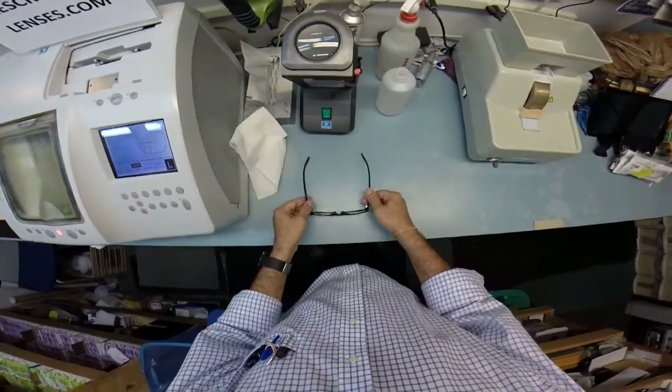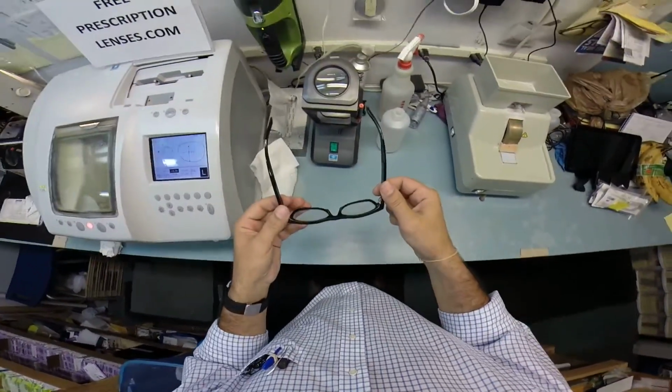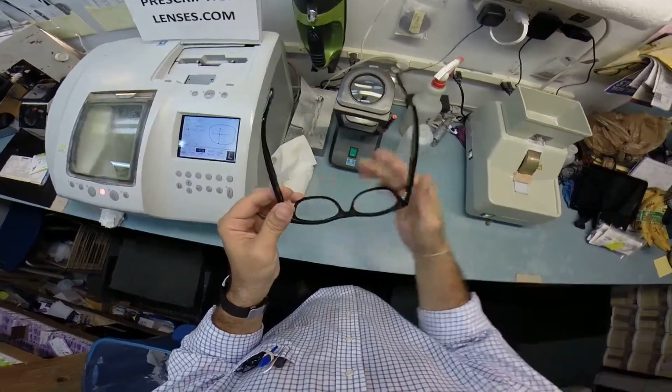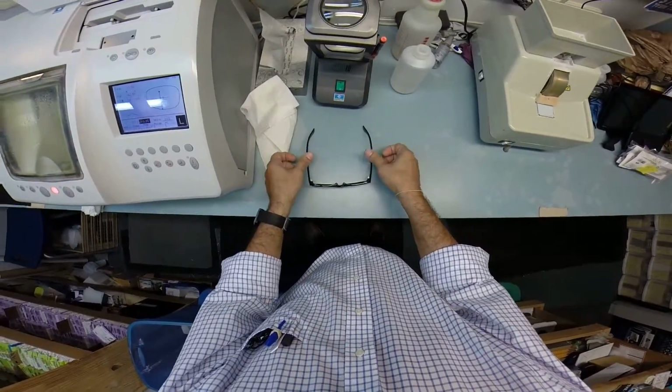But I'm going to set them on the counter and make sure they're in standard alignment. Standard alignment, also known as a 3-point stance. Those 3 points are 1, 2, and the bottom of the frame being 3. I press down and there is no wobble.